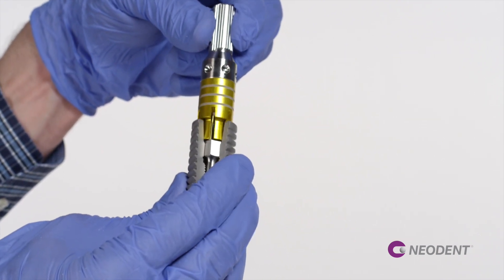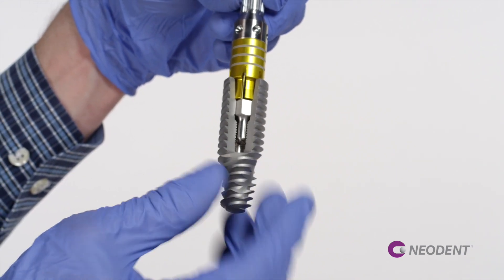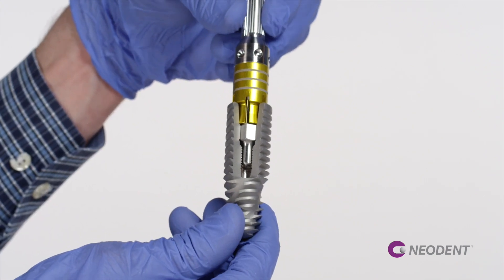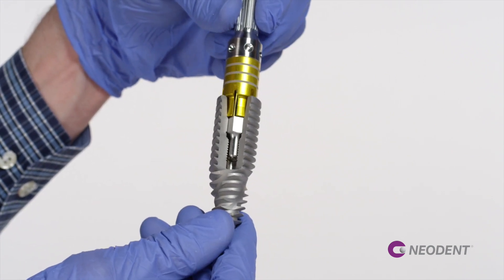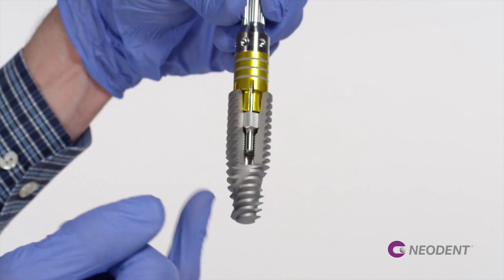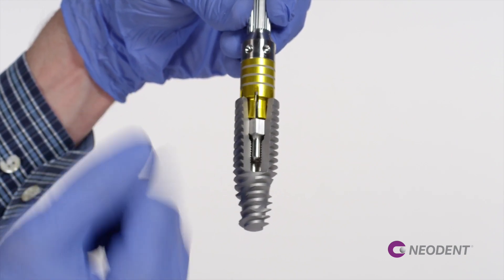When you put those two parts together, you can explore more about all those features. So we can see the engagement area, very solid and robust. We see where the implant is stabilized through the implant driver. And also you can explore the thread design in the bottom and the thread design in the top of the implant.